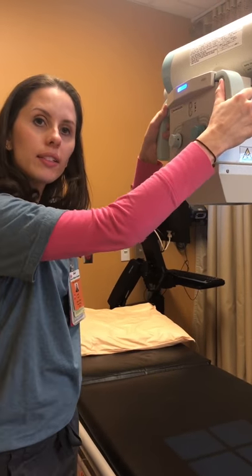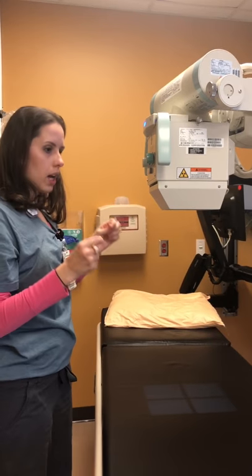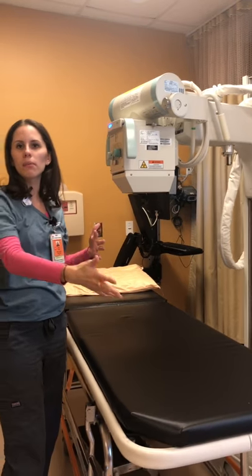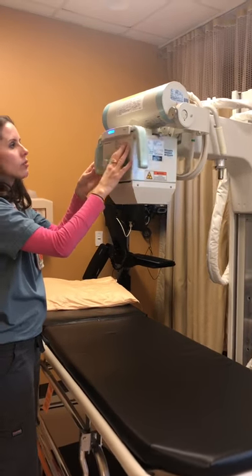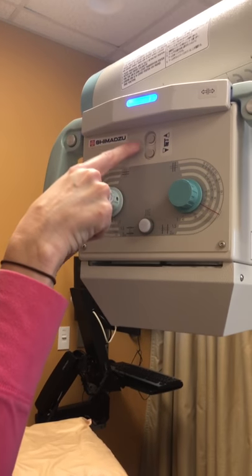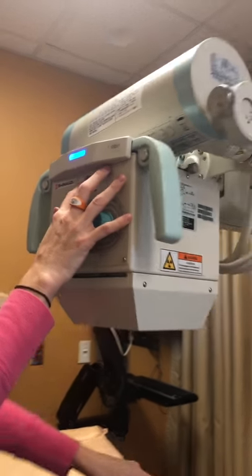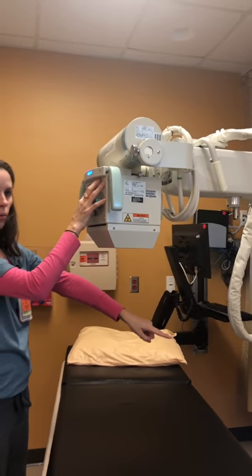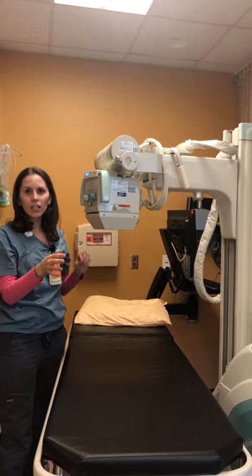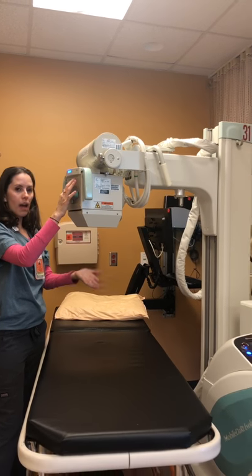If you are in a tight space and you need just a couple more inches but can't get over there — like there are people in the room or something might be happening — you actually have drives on the machine itself. There are these two top buttons. If you hit them, you can drive the portable forwards incrementally — it's very small and very slow, so you're not going to take anybody out or hit anything too hard.